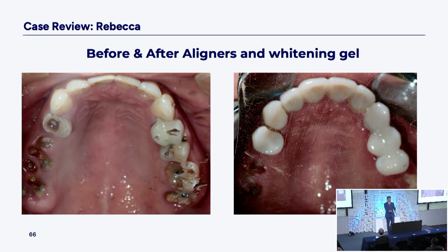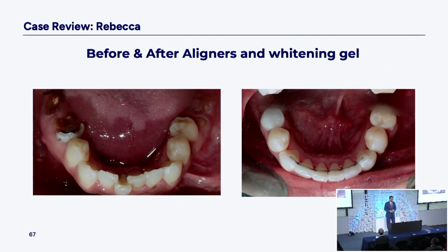It's a big case, you could imagine what you're doing here. You're not worried about if we need an extra temp. So put the permanent cement, totally safe. We're gonna move those teeth, line them up nicely. This is a very rare placement of a lingual bar. I do this once a year maybe.